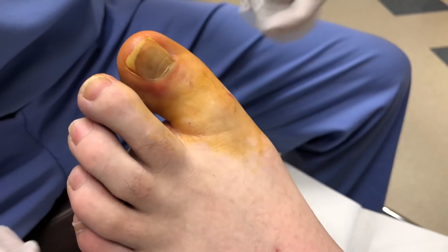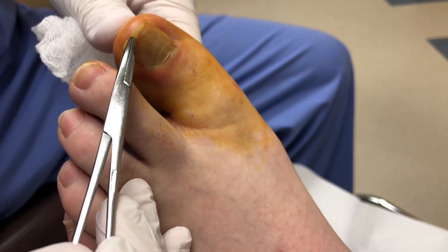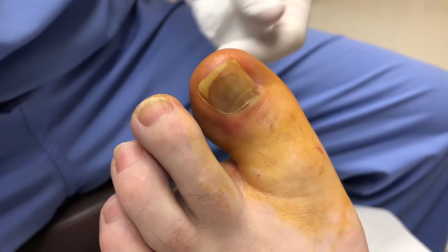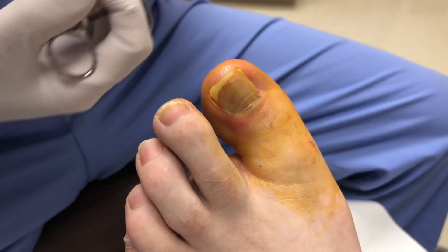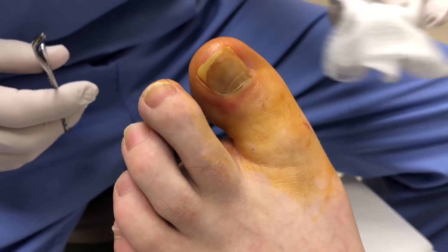This is Dr. Brennan with Healthy Feet Podiatry. We have a toenail here. You can see this gentleman caught his toe and this is all some dried fluid that's underneath the toenail. So we numbed him up in order to get the nail off because it is loose. We also want to make sure that no infection occurs within the nail itself.